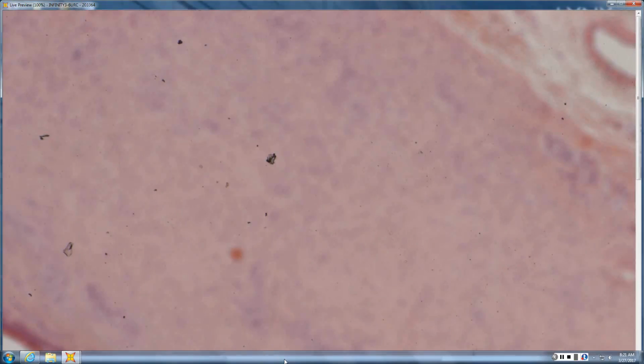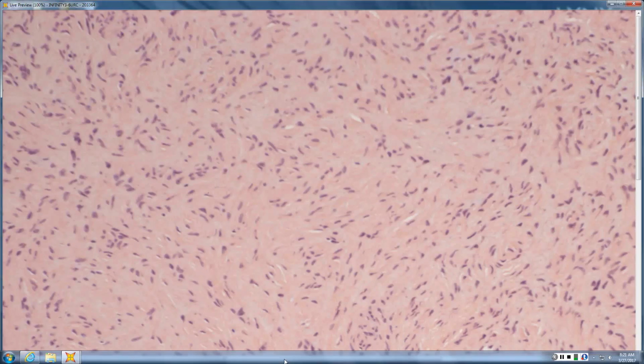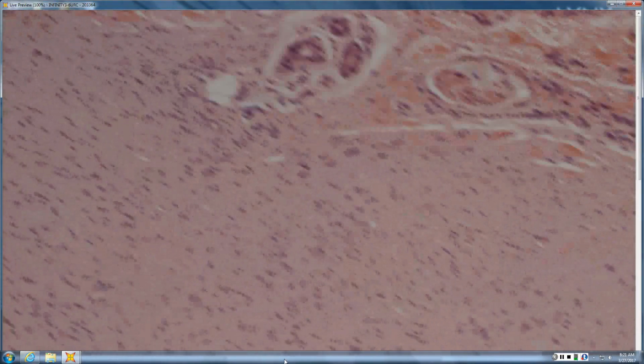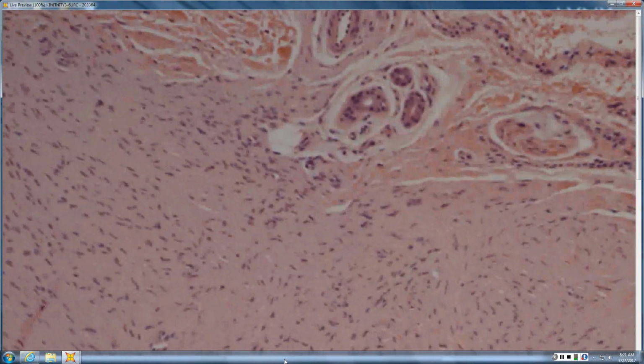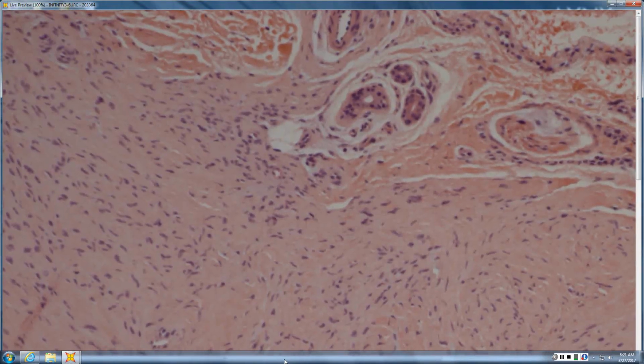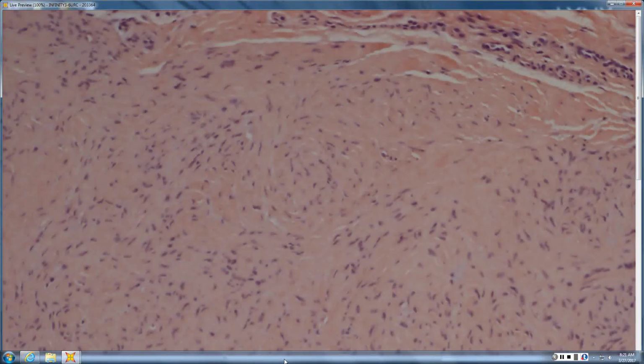Looks kind of like a neurofibroma. It's somewhat large. It's not quite hitting a diffuse NF. It's certainly not going down to fat. It is making these kind of whorl things. And when you stain it, it's not S100 positive at all. So it could be the meningocele as well.